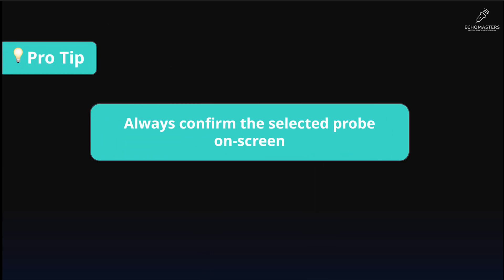When you select a probe, always double-check that the selected probe is the one that appears on the screen. Every probe has a label on it, like X, S, P, 5-1, or whatever. Just double-check that this label is the same one that appears activated on your screen before starting scanning.